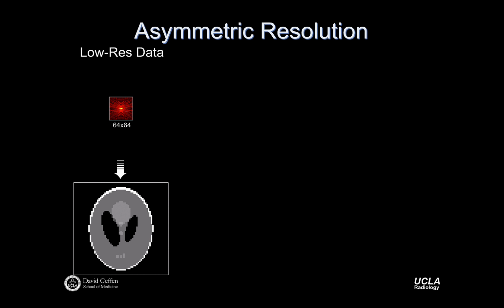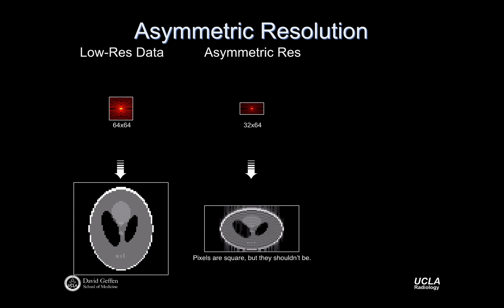And so if you use Osirix or other imaging tools, you actually have an option. You can zoom in on the image, and it'll keep the pixel resolution accurate and make these big blocky pixels. I prefer that because it actually tells me what my data looks like, right? Another option is to turn on, I forget what they call it in Osirix, but other imaging viewers have the same. What's that? There's an interpolate kernel, yeah. So you can flip that on, and then this image will look smoother. I don't necessarily prefer that.